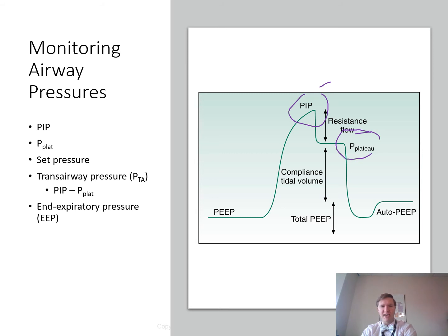Trans-airway pressure is the next bullet point. Trans-airway pressure, and there's the equation right there, is your PIP minus your plateau pressure. So the difference between PIP and plateau readings is the trans-airway pressure. It's the amount of pressure required to overcome the airway resistance, right? So how do I calculate airway resistance? I'm glad you asked. You're like, I didn't ask, Derek. Why are you giving me calculations? Because they're awesome and they represent physiology and they help you take care of patients more appropriately.